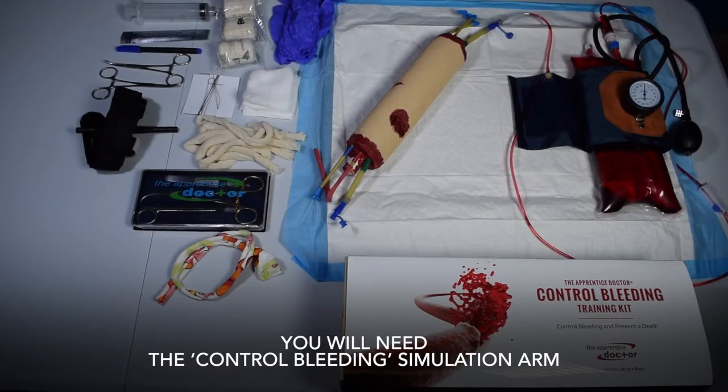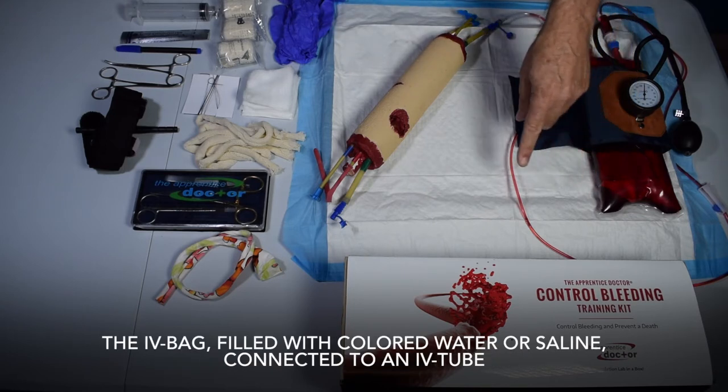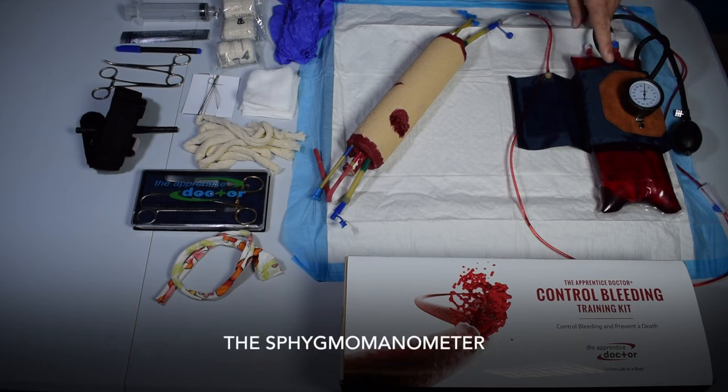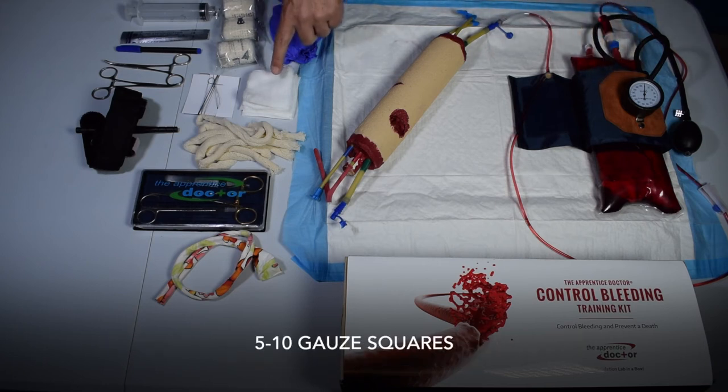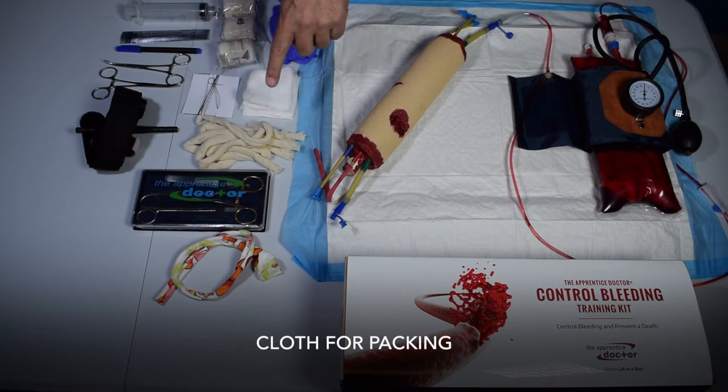You will need the control bleeding simulation arm, the IV bag filled with colored water or saline connected to an IV tube, the sphygmomanometer, 5 to 10 gauze squares, a roll of pressure bandage, and cloth for packing.